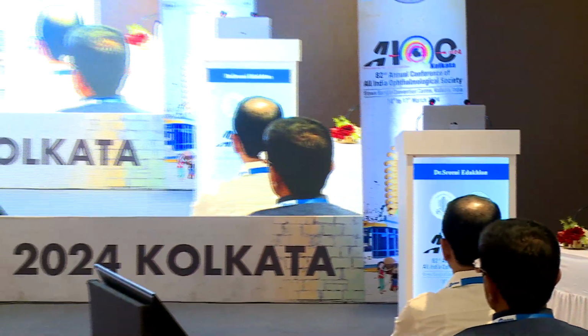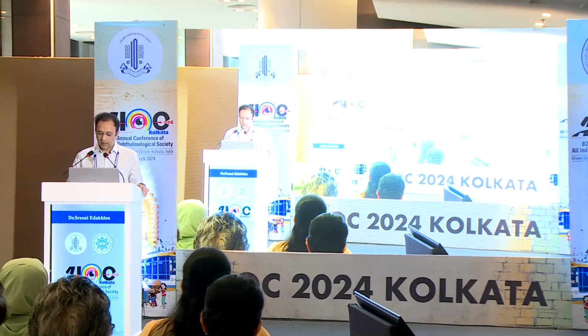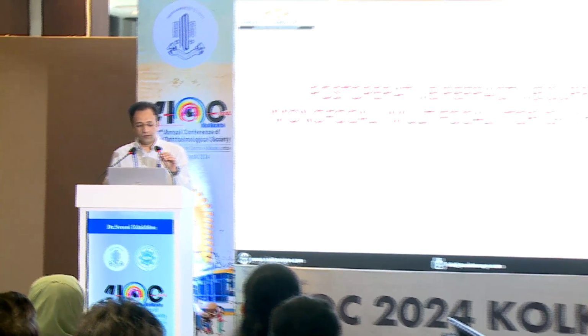I'm sure all of us have faced this. Very common for us. Most of us have seen postoperative surprises. When we do monofocal, it's easy to manage. Usually it is plus 1 or up to 2. It is easy to manage, especially if it is the minus side. Patients also don't complain because they have very good near vision.